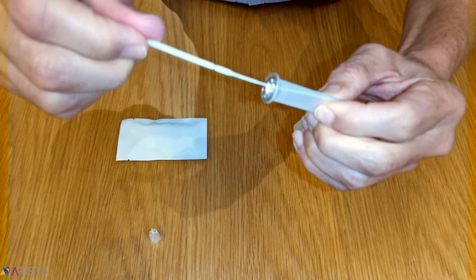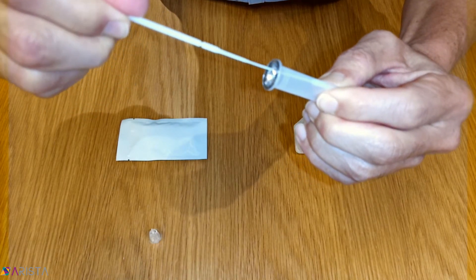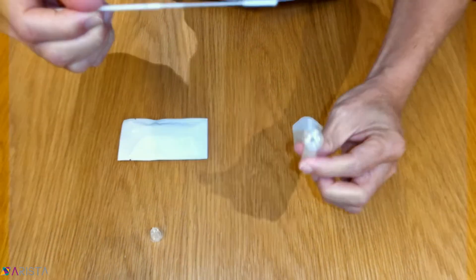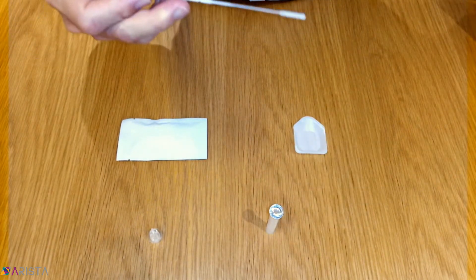Remove the swab while continuing to squeeze the sides of the tube so as to extract all the liquid from the sponge tip. Then safely dispose of the swab.